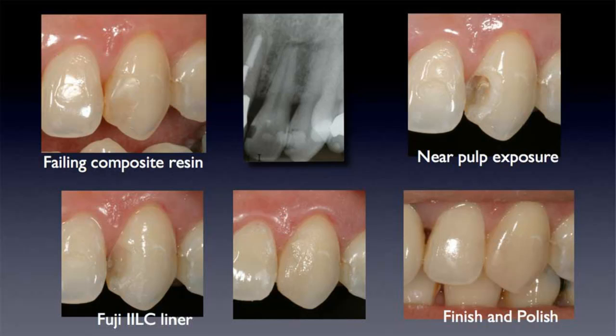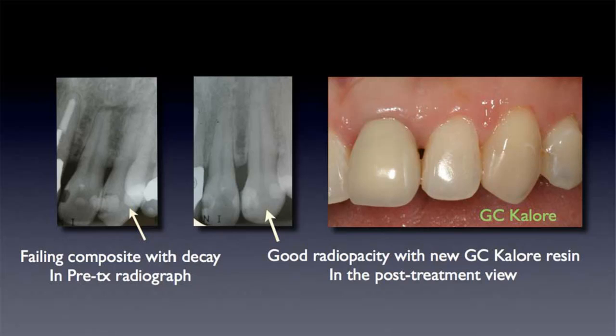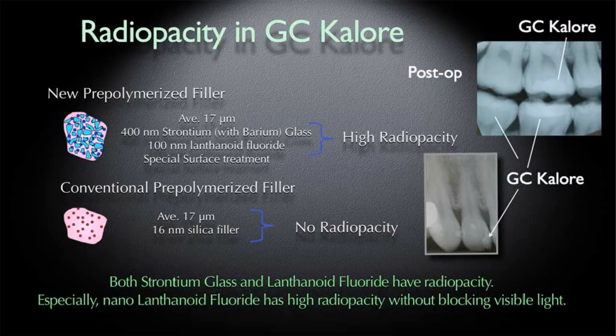First of all, one of the things that I'm going to do is create a putty matrix before I prep my tooth. And it looks just like that. You can use any putty you want. I'm using Excellence putty in this case, but you want to have the anatomy of the lingual and the interproximal area defined right along here, so that you can create that anatomy as you are building that lingual shell, as we're going to talk about soon. And then from there, the different preparations that we're going to do, I'll show you very specifically how that's important.